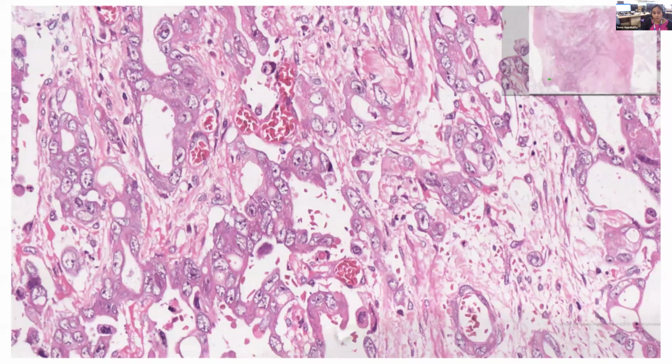So individually, the tumor cells are quite enlarged with pleomorphic nuclei, high nucleocytoplasmic ratio, prominent nucleoli, irregular nuclear membranes. What do we have here? The red blood cells, they look very much like sickles. Some of the extravasated red blood cells also look quite sickled.